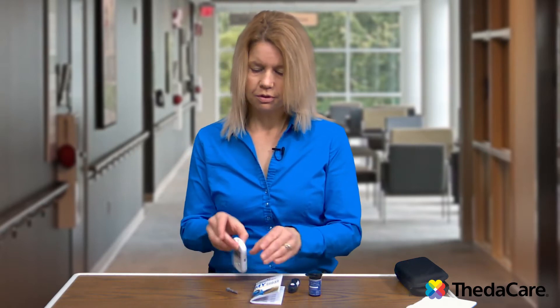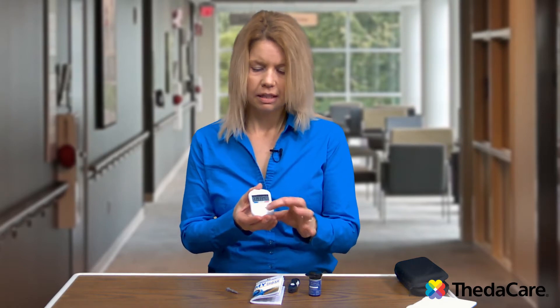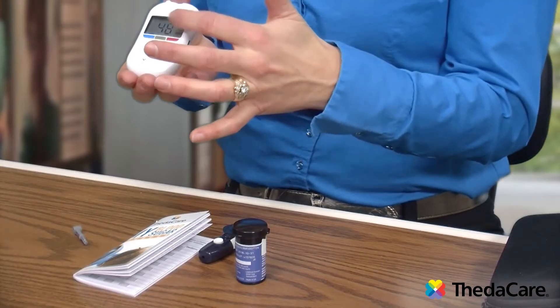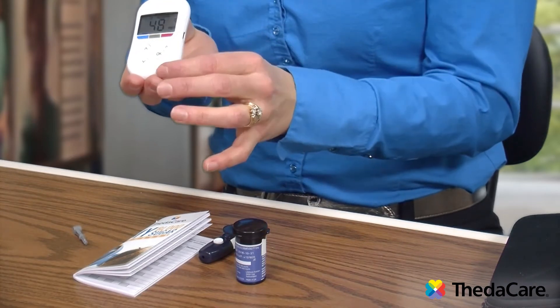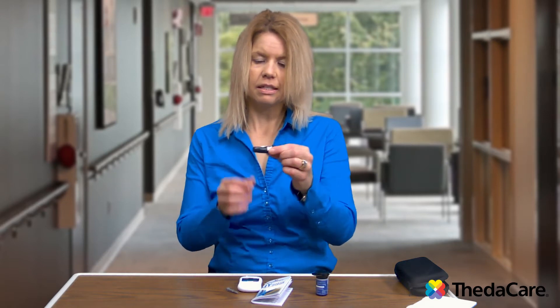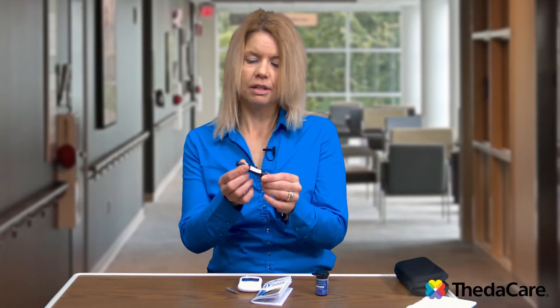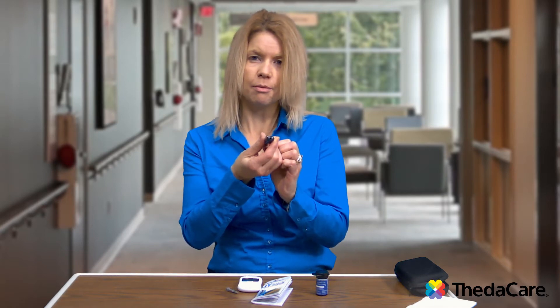When checking your blood sugars, first you take your glucose meter and turn it on by the power button. When it is new, you'll need to adjust the time and the date — usually the date is correct but the time is off. To get your glucose meter situated, you first take the lancet device. This is the device that you'll use to poke your finger with. You can see there is a little hole at the end, and that's where the needle is going to come out.